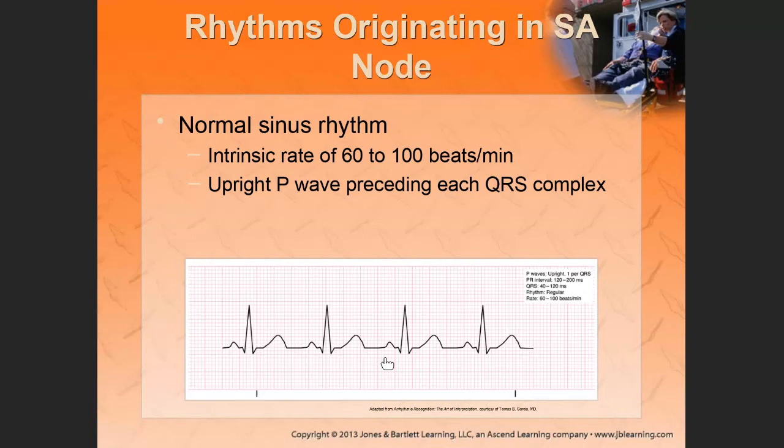So you need to know what a normal sinus rhythm looks like, because you're going to see it again. I can guarantee you that. Okay? For sure. So this is a normal sinus rhythm.